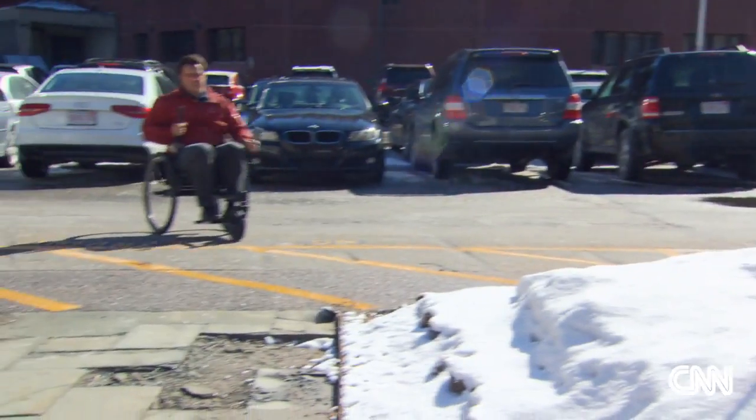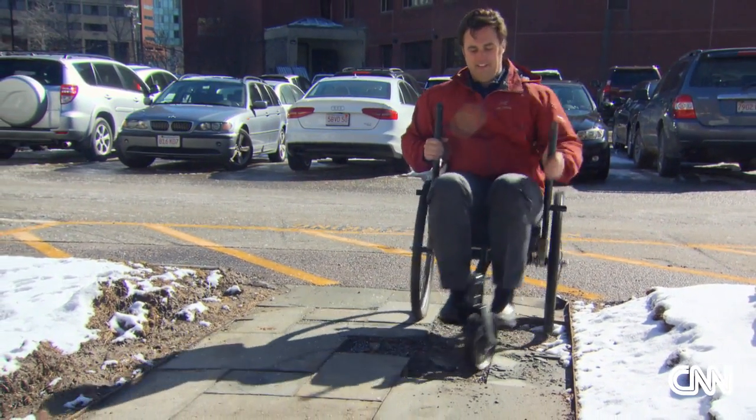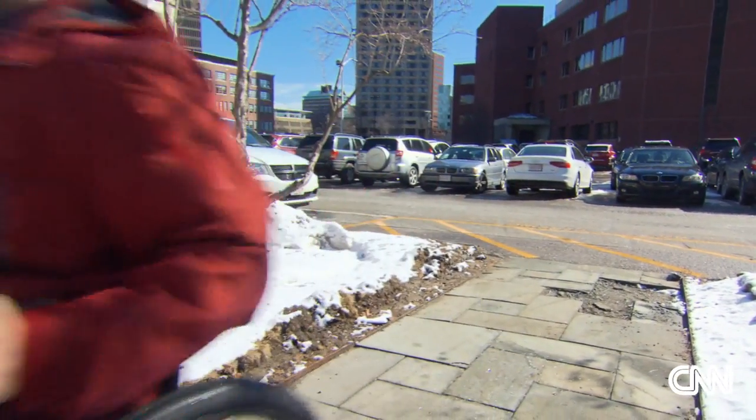He noticed that people with disabilities there had an especially hard time getting around. If you live out in a village, there was no single product that would enable you to travel long distances on rough terrain, but also be small enough to use in the home.